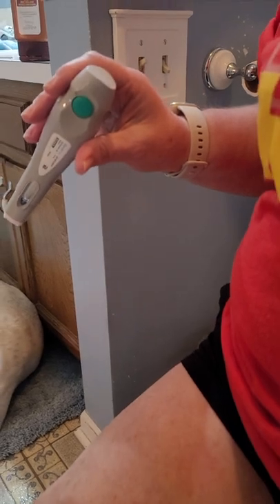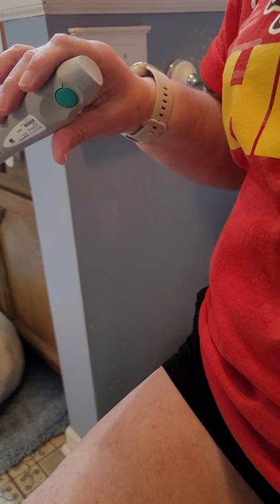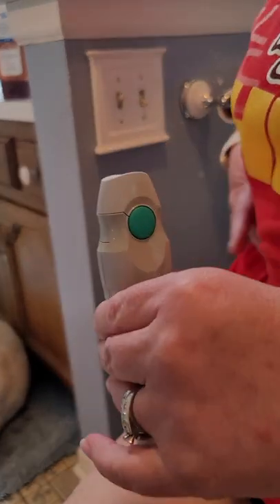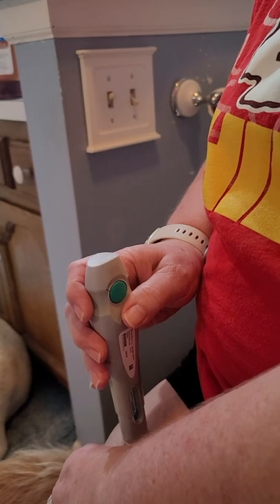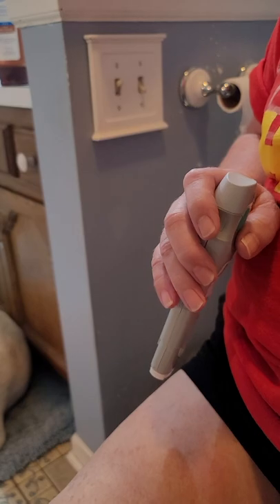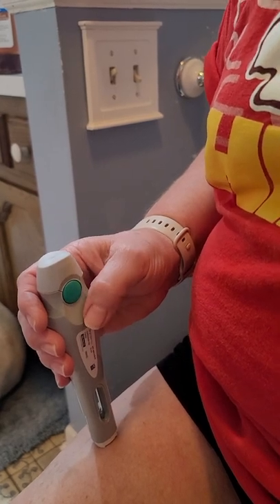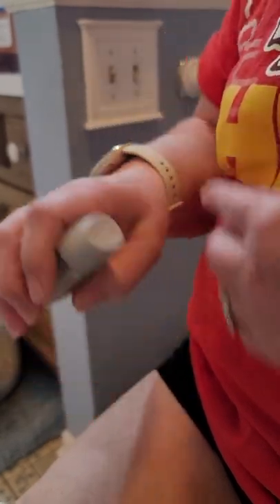Calm it down, Rizzi. You're going to have a lot to edit out of this video. Okay, this is what we're doing. We pinch the skin. I'm going to push this down and then I'm going to push this green button. Why can't I do it? It's just like your other ones. I mean, it's really simple — push it down and then you push the green button and it injects itself. I've done this so many times with Cosentyx. It's just new. Deep breath. My heart rate's back to 100 now.